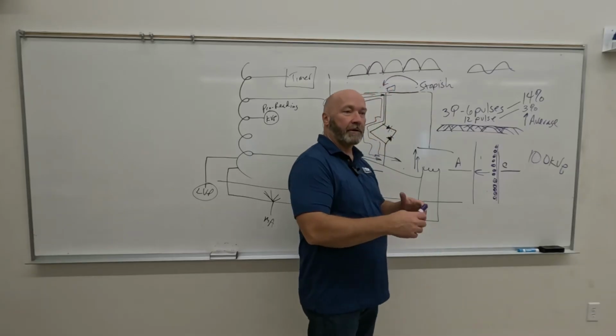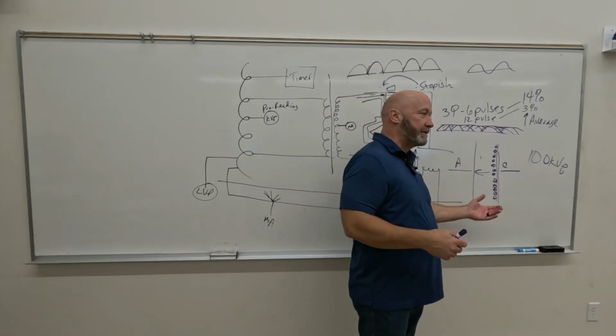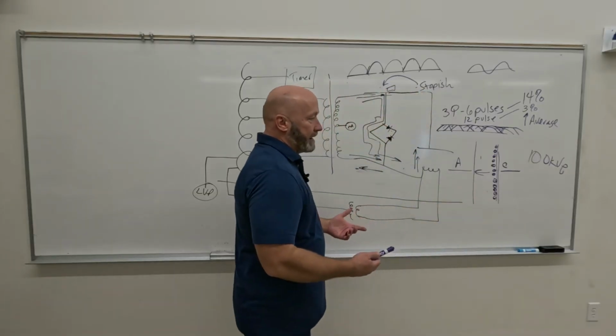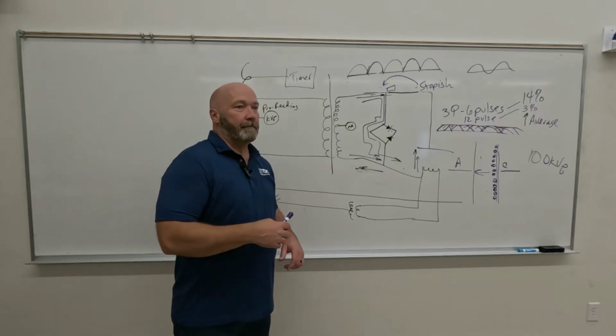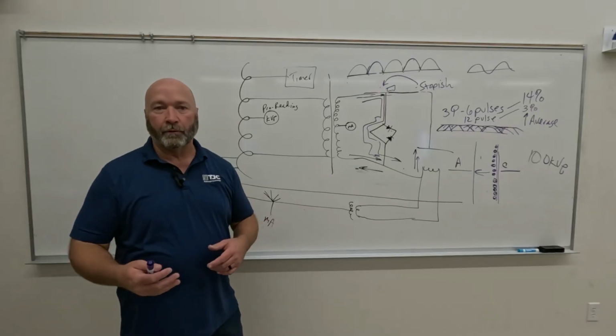Okay, so then they travel across that, and that's your discharge. Your capacitor is building up the charge, and the discharge is allowing the electrons to jump across. As a capacitor discharge type X-ray unit, I've never worked with one, and they used to be fairly common in portables.